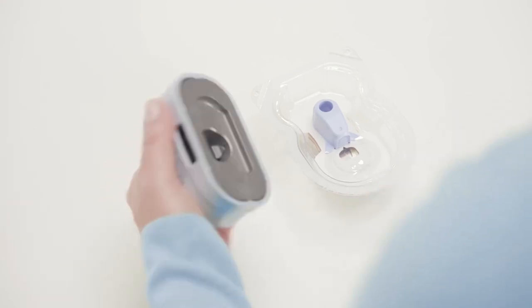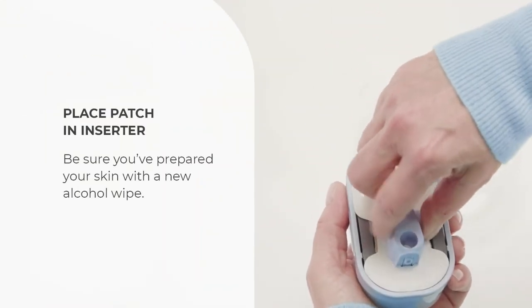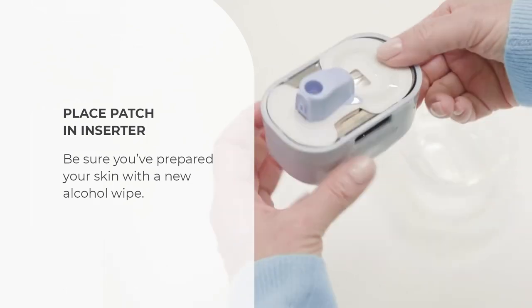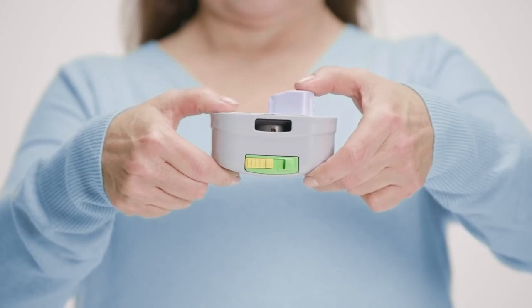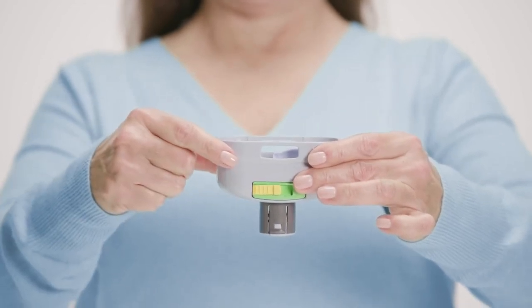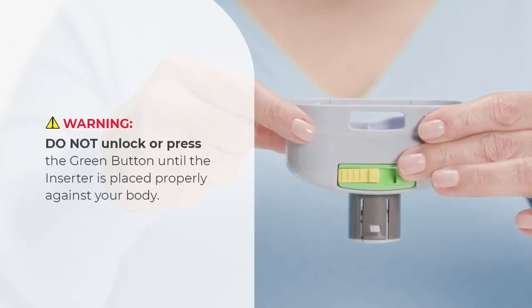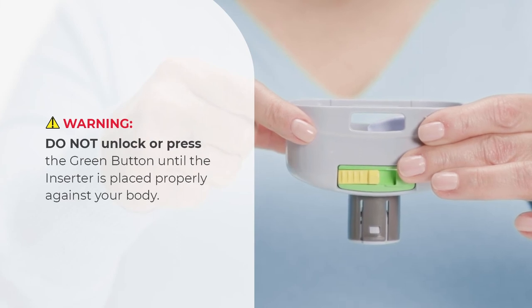To place the patch into the inserter, pick up the patch by the blue cap and place it into the inserter in either direction. Be sure you've prepared your skin with a new alcohol wipe. Hold the inserter with both hands and use your thumbs to push down on both the blue cap and the patch until you hear a click. You will see a cylinder pop out on the other side. The patch is now locked in a spring-loaded position, so do not unlock or press the green button until the inserter is placed properly against your body.